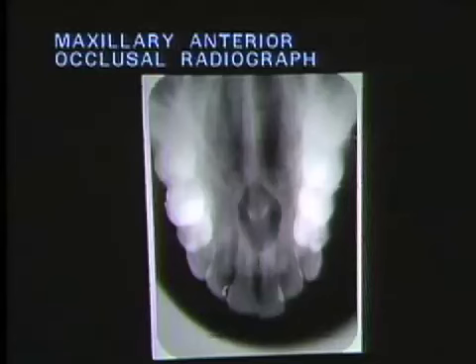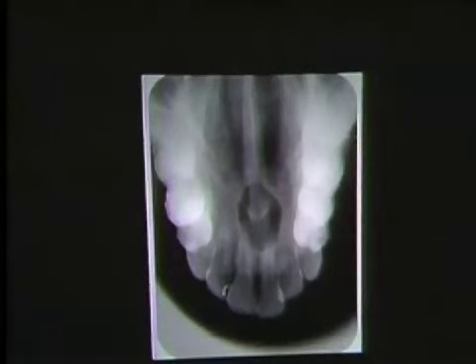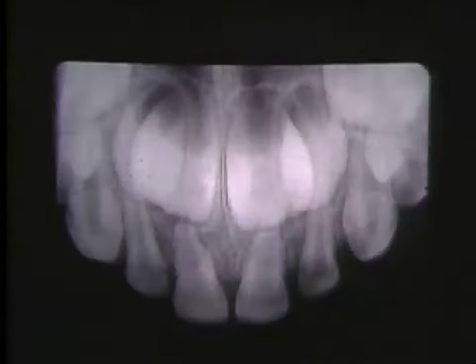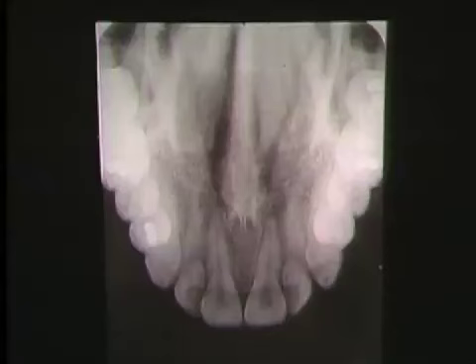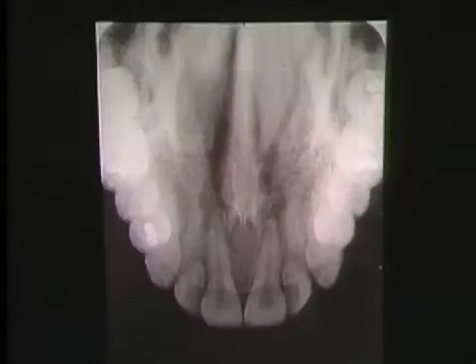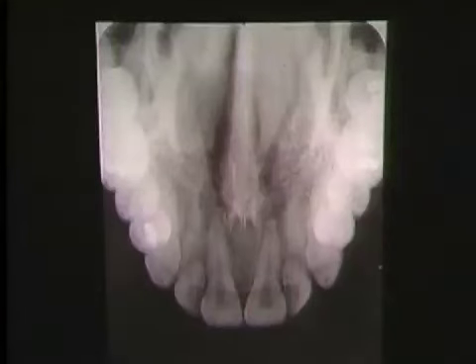The maxillary anterior occlusal radiograph shows large areas of the anterior maxilla and palate. It can complement periapical radiographs for large lesions, or replace the periapical film in patients with anatomic limitations to film placement. An ideal maxillary anterior occlusal radiograph shows the maxilla symmetrically placed on the film, with the anterior teeth the correct length. There should be no overlapping of interproximal contacts.